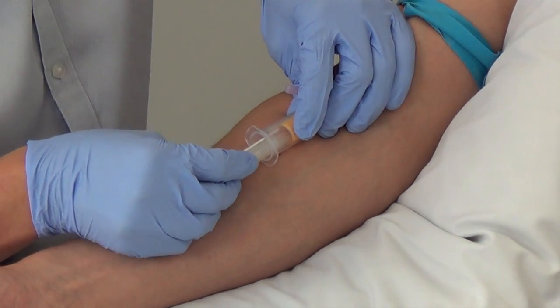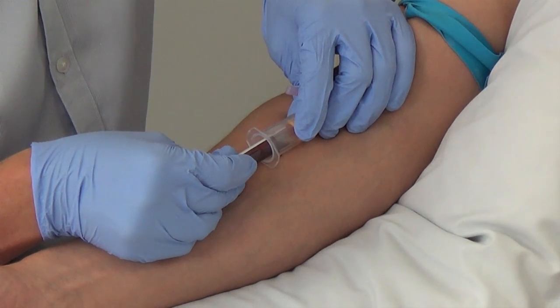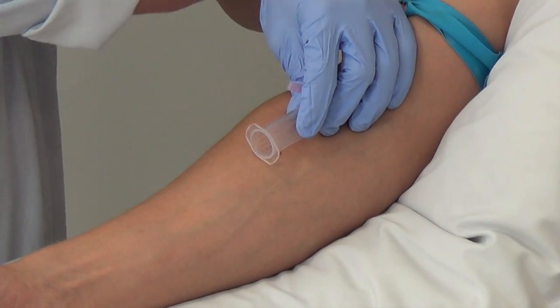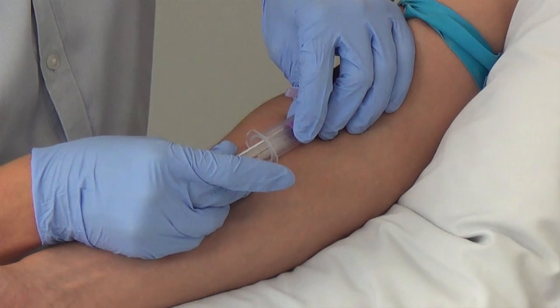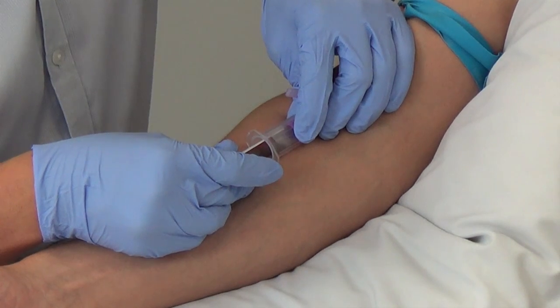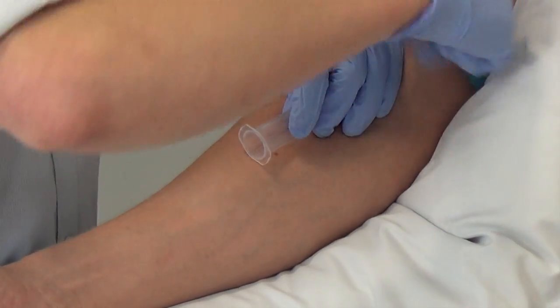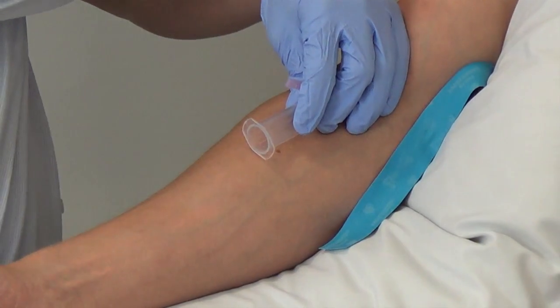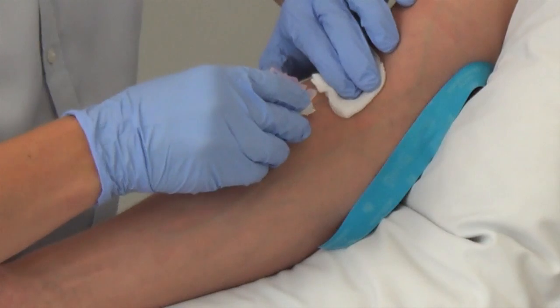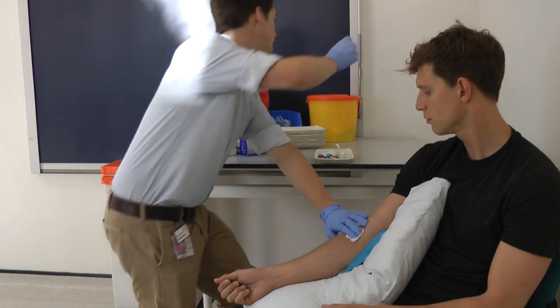And then just one more now, sir. So once you've taken all three, you can remove the tourniquet. Take your gauze and place it over the area, removing the needle slowly. And it's very important at this stage to sheathe the needle and to place the needle into your sharps bin.